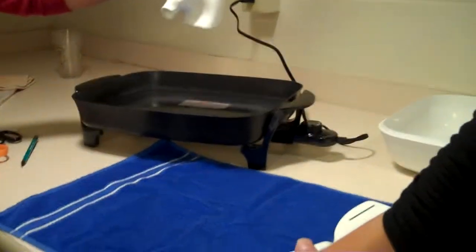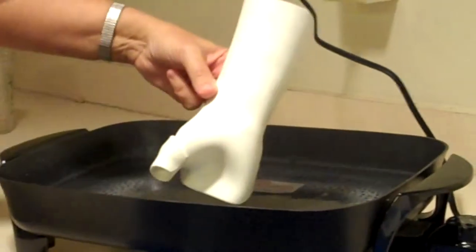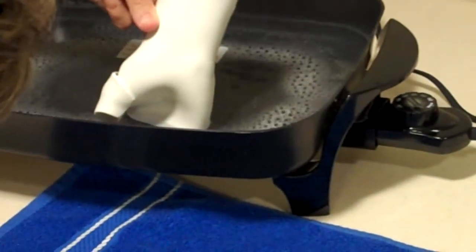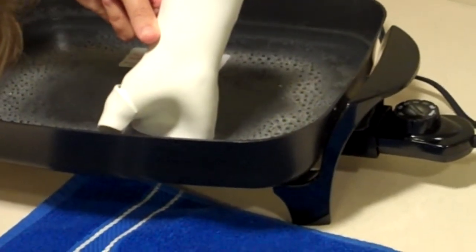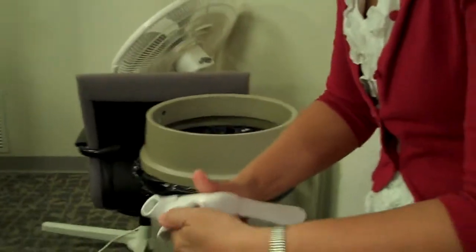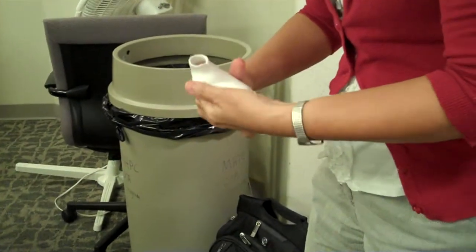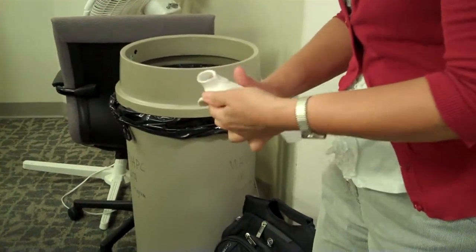So you could either use the heat gun. I think this works a little bit better. Just have to remember it's super hot. The heat gun just provides concentrated heat, like a hair dryer. You've got to be careful holding your fingers. Yeah, that's good. Now you can see that it's already hot enough that we can start rolling it. And cosmetically, that makes for a nice splint, to have a rolled edge like that.